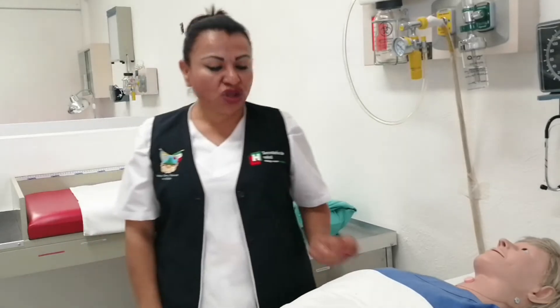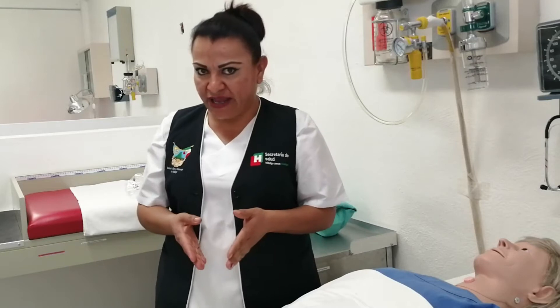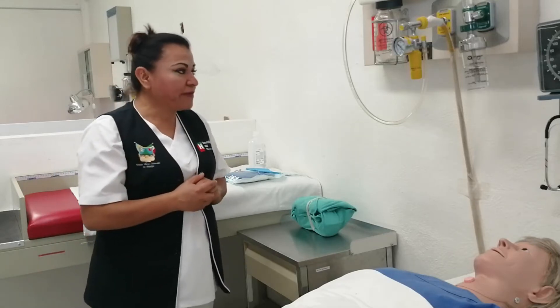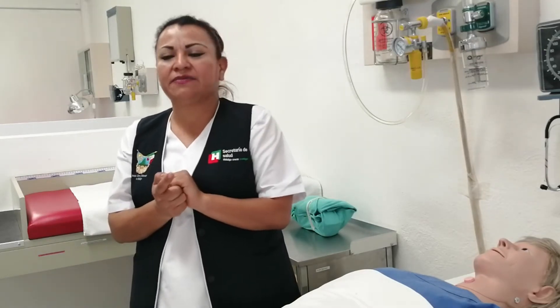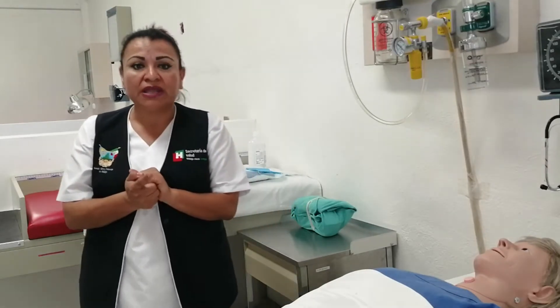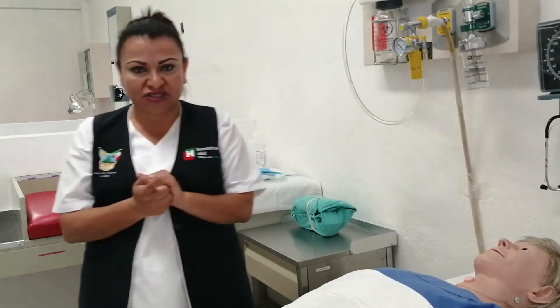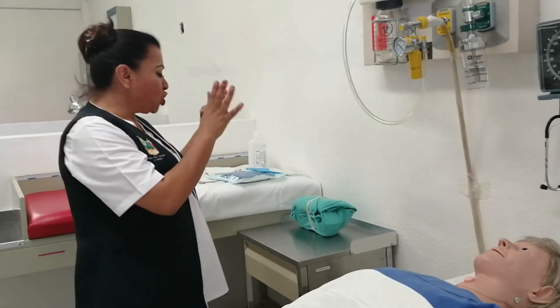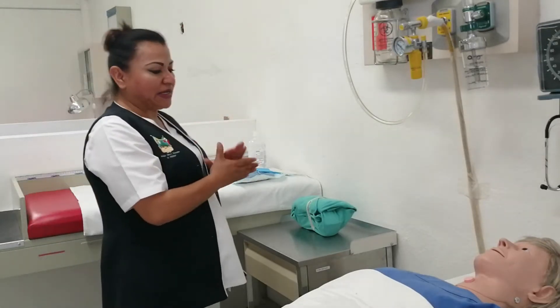Procedimiento. Lo ideal es que se realice con dos personales de enfermería. Lo primero es lavarse las manos, ya que el lavado de manos nos va a ayudar a disminuir las enfermedades asociadas a la atención médica. Me lavo las manos, reúno todo el material y equipo mencionado y lo llevo a la unidad del paciente.